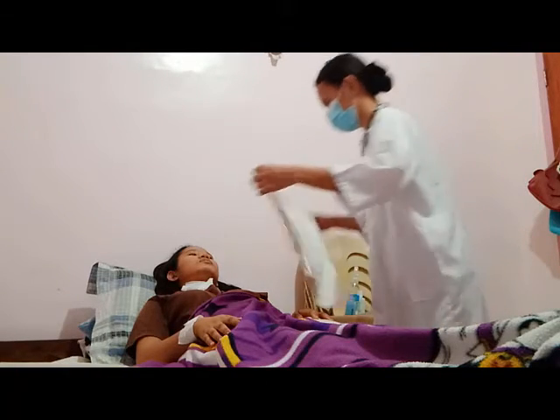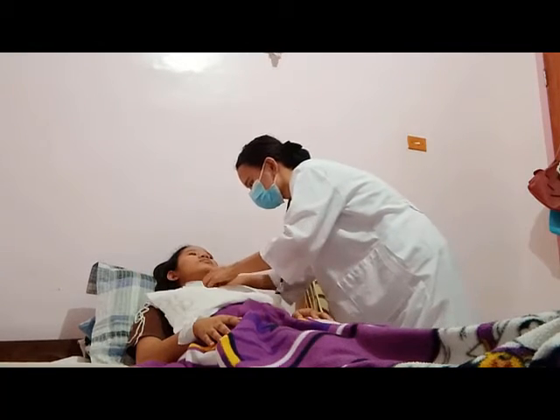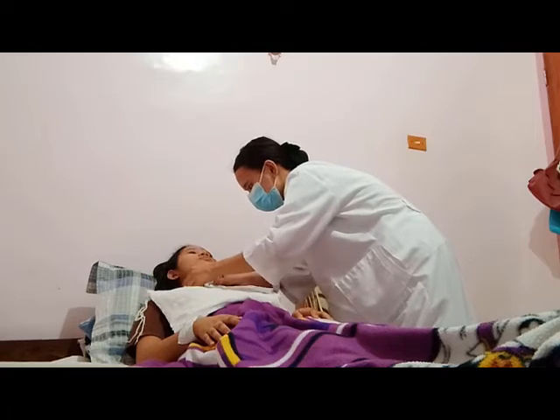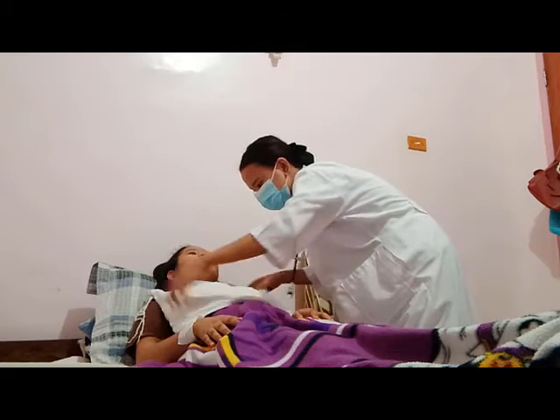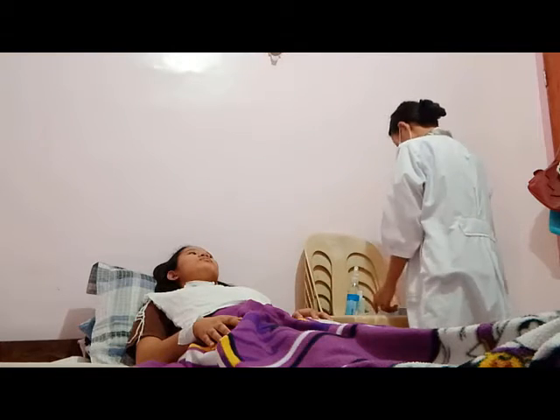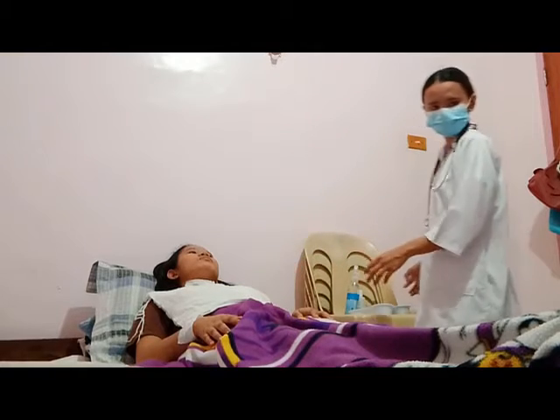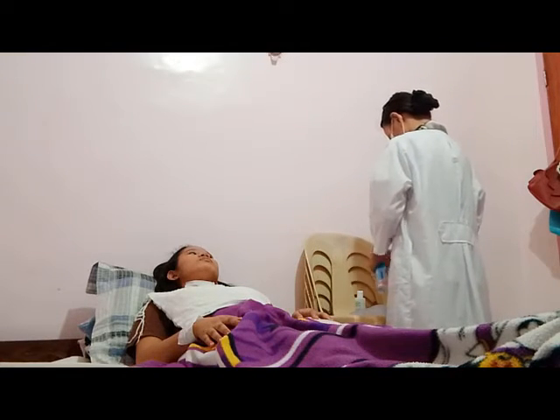Place the towel below the tracheostomy site, covering the neck and the chest of the client. Put on a face shield or goggles and mask. Suction the tracheostomy if necessary. If the tracheostomy has just been suctioned, remove the soiled dressing and discard before removal of the gloves used to perform suctioning. Prepare the basins and cleansing solutions.